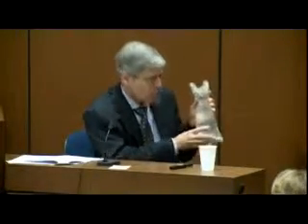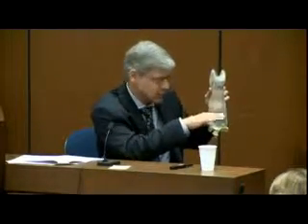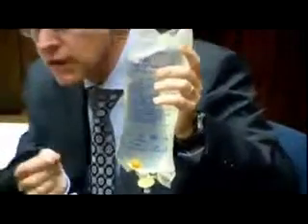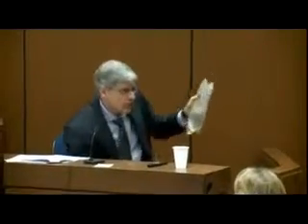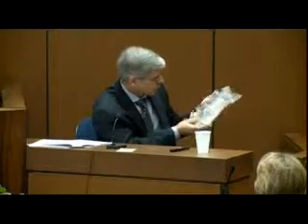In anesthesia, we always have such a bag. It might be saline or it might be something a little bit different, but not much, a clear solution like this. We always have this going into the patient because we need a way of getting drugs directly into the patient's vein. And so this is sitting above the patient with tubing that comes out to take the drugs right into the vein of the patient. And it's always there and always running just a little bit so that we can get drugs in when we need to. Now, there are several features about this I just want to point out.